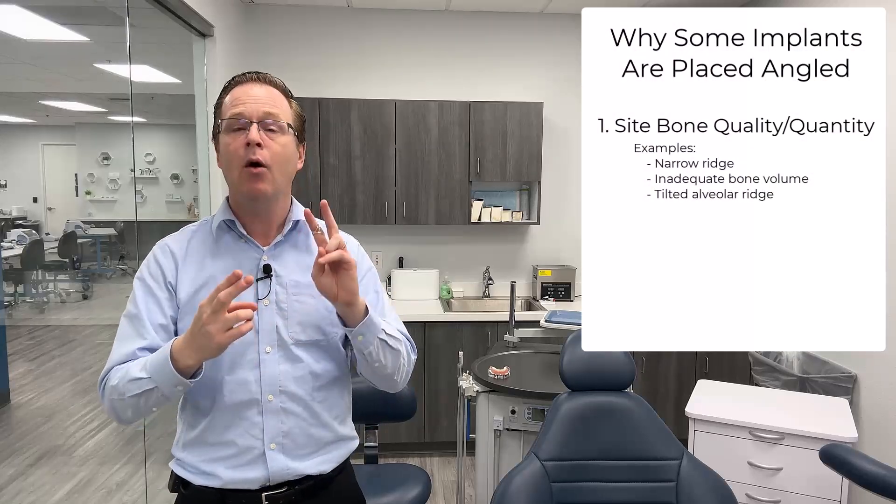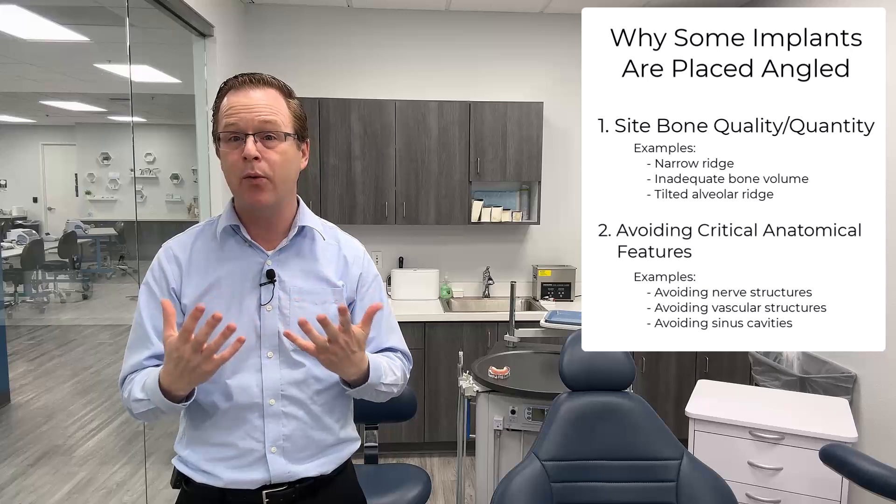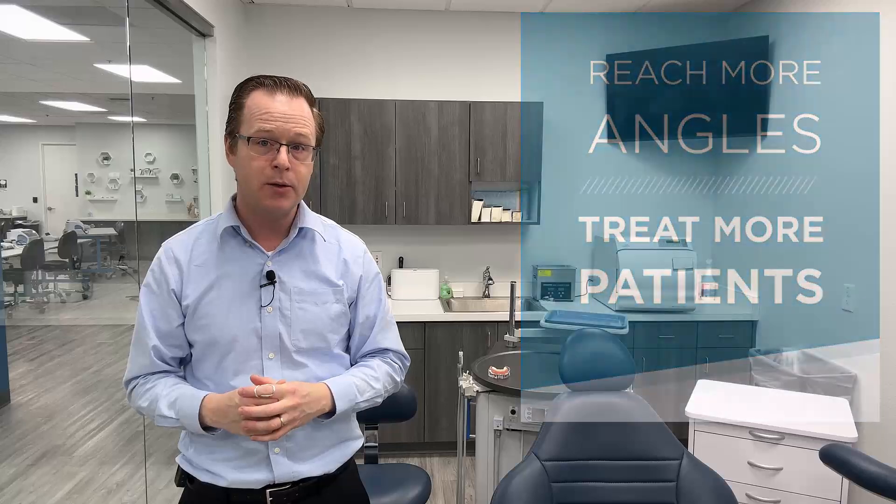So what happens now is we start thinking about those challenging cases in our practice where sometimes the implants are not placed perfectly parallel. I know we try, but sometimes there's just bony anatomy or critical anatomy like nerves or sinuses that we want to avoid. So sometimes implants come out with a little bit of angulation. As a general rule, we want to place our implants straight and parallel to the occlusal surface or to the prosthetic surface of our restoration. But because of some of those limitations, we have to place our implants at those slight angulations.